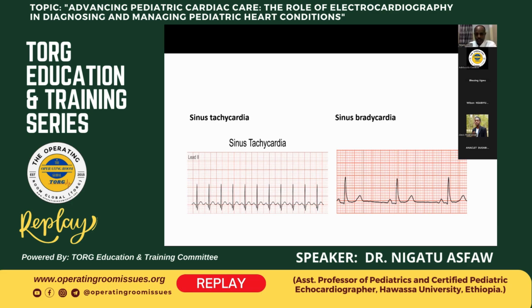So this is sinus tachycardia. And in sinus bradycardia, there will be a low heart rate for age, and there will be a P wave before every QRS complex.